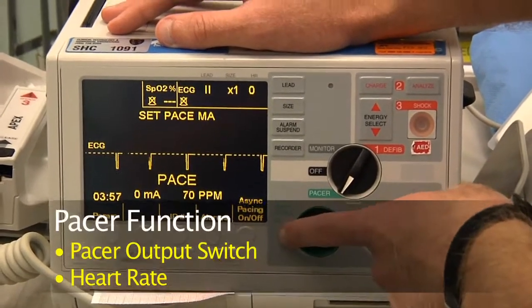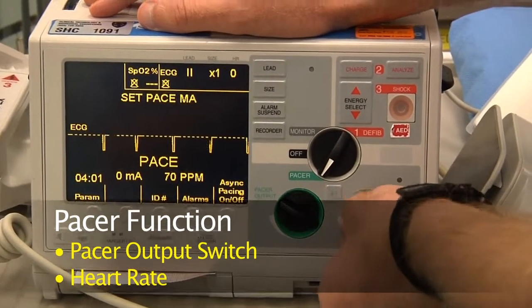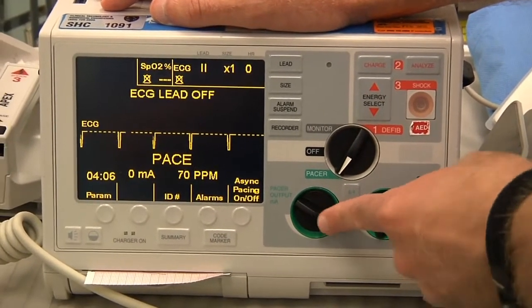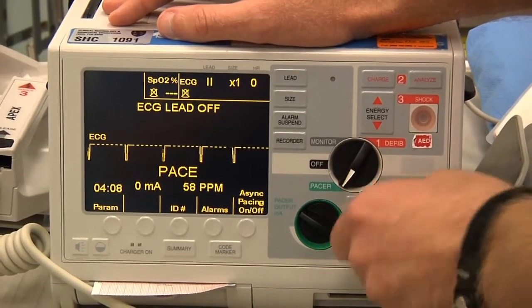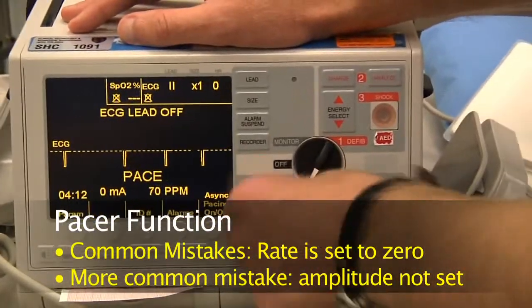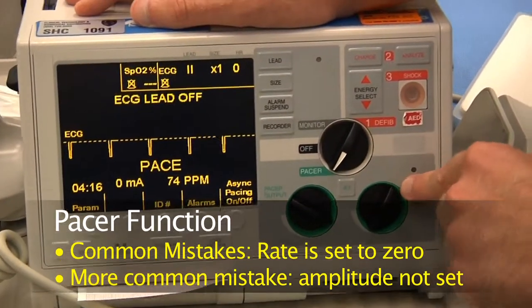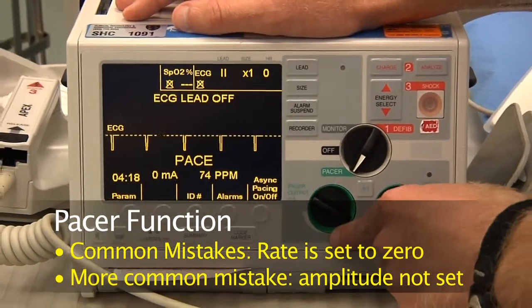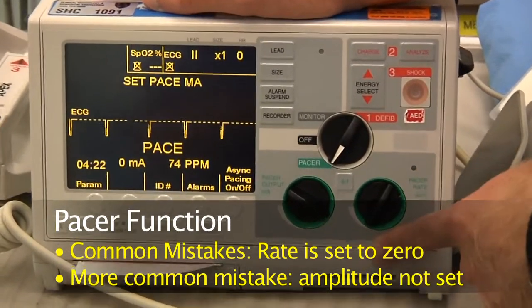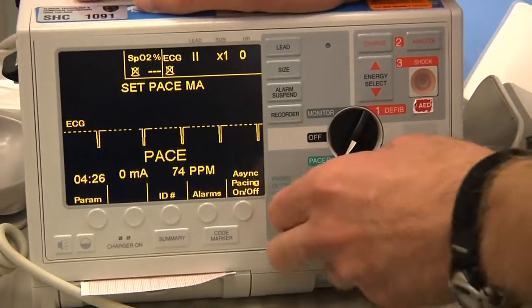You have the pacer output in milliamps and the heart rate. Now the heart rate is just what you set, but if you don't set the output high enough, it doesn't matter what the rate is. So common pitfalls: either the rate is set to 0, so no matter how much you go up in the amplitude, you don't get capture, or more commonly, the rate is set to a certain beats per minute, but you never go up on the amplitude, so you never get the energy going out. It doesn't matter what the rate's set. So you have to remember it's a double hit. You want to set the rate and set the output.